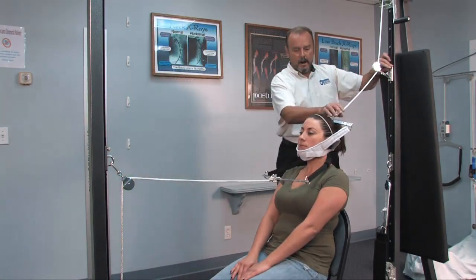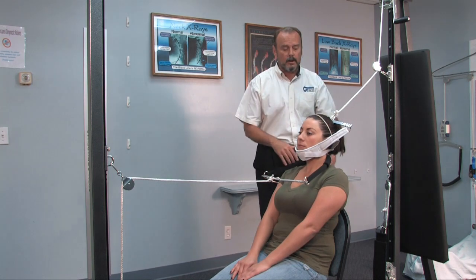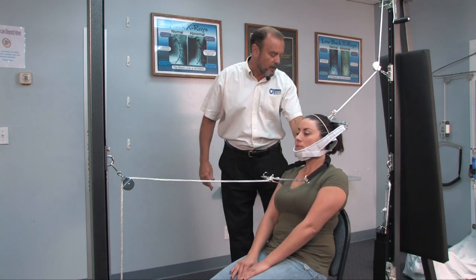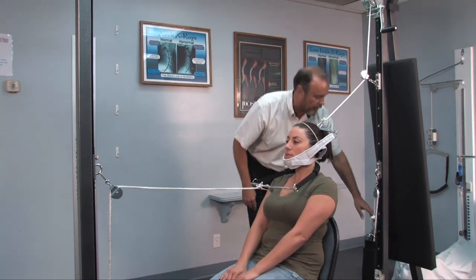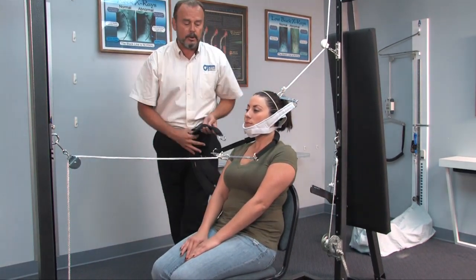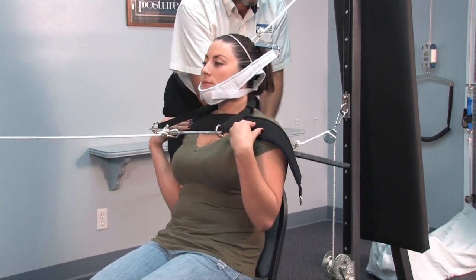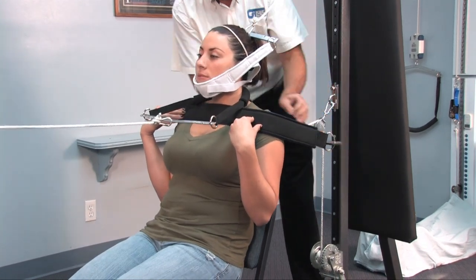This pull is just about right. I want a little higher pull up from the back if I'm going to pull low into the lower front neck. This type of setup is especially good for people that have loss of curve in their lower neck and maybe even in their upper thoracic spine. As we pull the curve into her lower neck, we do not want to pull her completely out of that chair, so it's good to also just hold her shoulders in place.